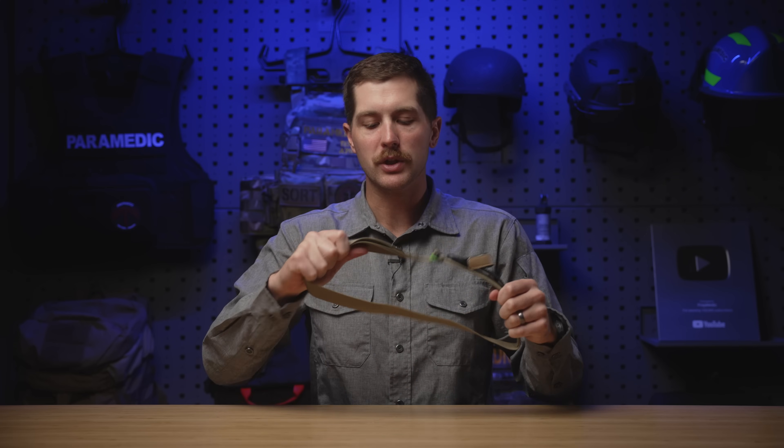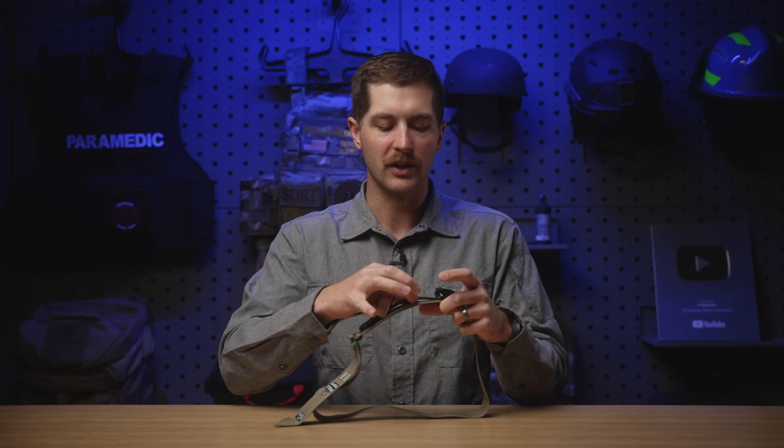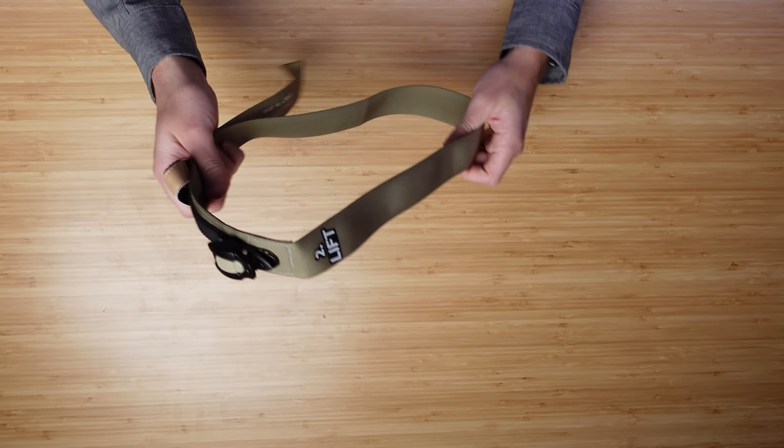That's the same with a lot of tourniquets — the CAT tourniquet has an internal band, and I'm not sure if it's 0.75 or one inch. Just because most of the band is wider, you're still going to have a smaller piece of band right there. Out of those three, the only thing to really take into consideration is: if you can fit the TX3, I like that thing and I'd use it in a lot of situations, but it's not as compact — which is where this RMT shines, because it's really, really easy to stow.